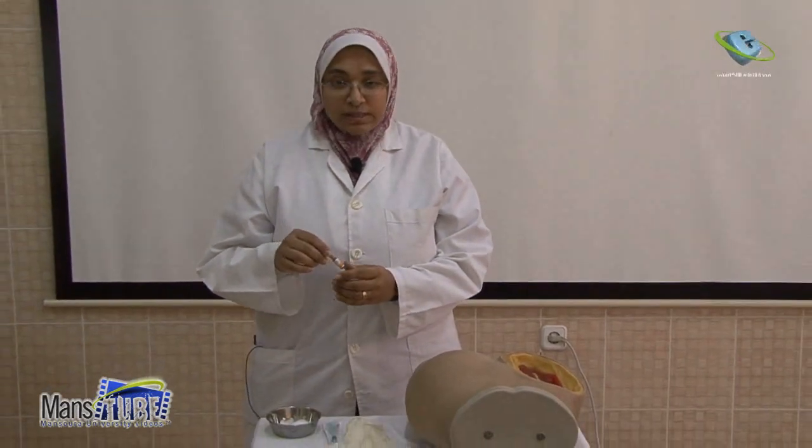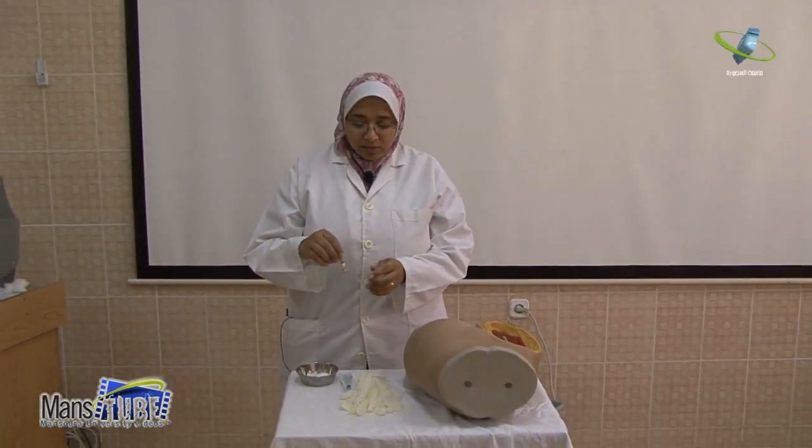I'm Fatma Gano, Assessor in the Medical-Surgical Department, Faculty of Nursing, Mansoura University. Today we will talk about intramuscular injection. First, we will start with how to prepare the medication, then give it to the patient. We have the ampoule prescribed by the doctor.